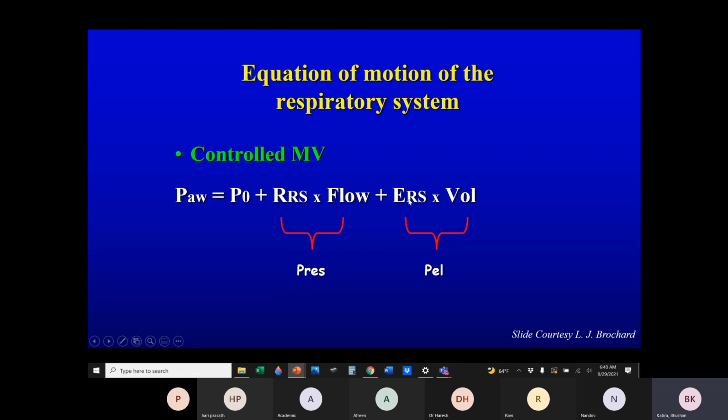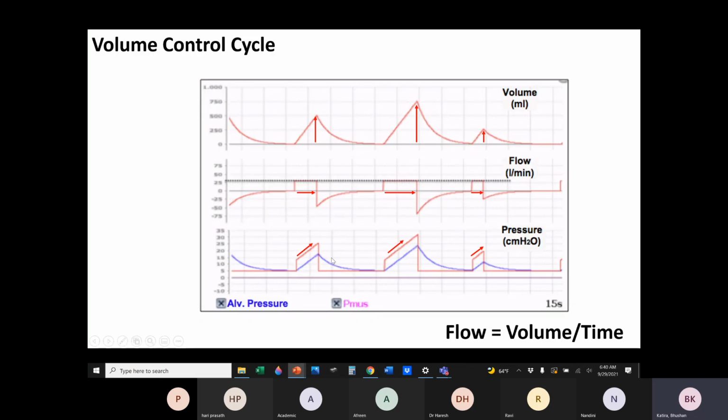The second part of the pressure is the elastic pressure, which is what the alveolar pressure is. From the peak to the plateau difference, as we said, we will see the plateau here again, is the resistive pressure. But from the plateau down to the baseline pressure, or the alveolar pressure, in this example, as you see from this spot to this spot, is the elastic pressure.